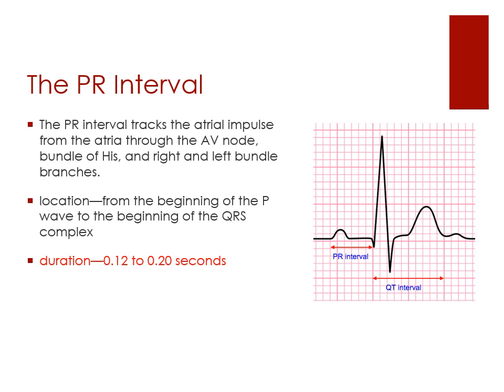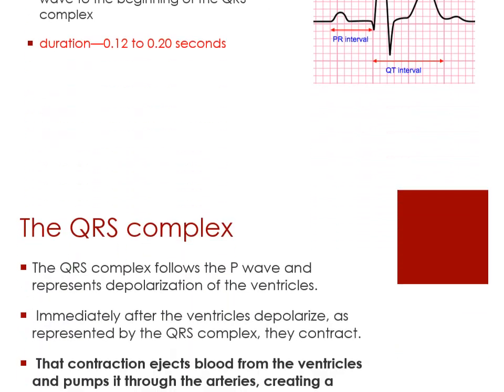That's tracking that atrial impulse from the SA node to the AV node. Remember, it's going to take a little time. It doesn't happen instantaneously. It happens pretty quickly, but that is what we call our PR interval. That's why you see that little lag time between that first hump and the dipping of that ventricular contraction. We call that the PR interval. Again, please don't worry about the time. It's there because you will see it again next quarter, and especially when you get into critical care. So the P wave is atrial depolarization.